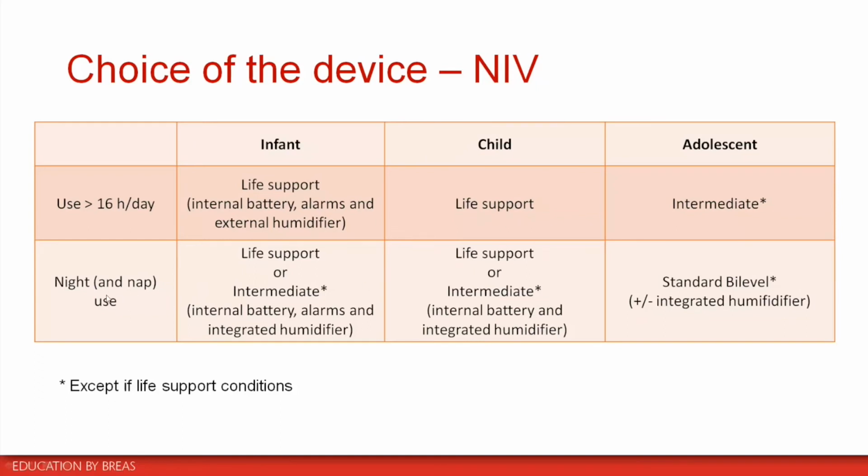And the same thing, if it's only during night and or nap use, we'll choose life support or intermediate. The same thing, the child has to be detected to be capable of receiving NIV correctly, to trigger the ventilator. And once again, if it's a life support condition, you have to choose a life support device.